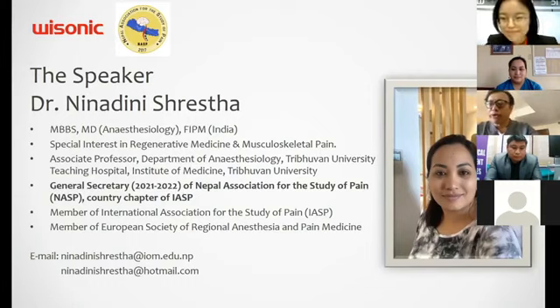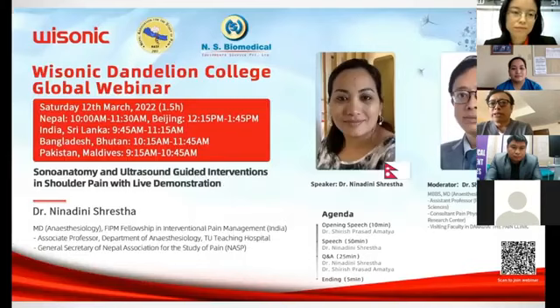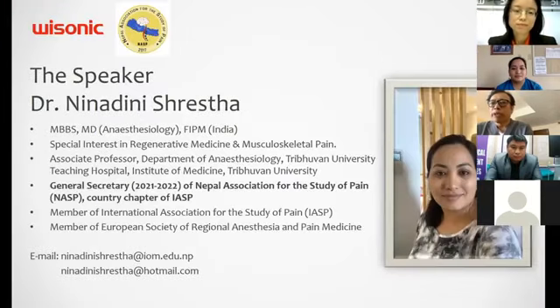Thank you, Mandy, for a wonderful introduction. Today, WeSonic, Dr. Ninadini and I, as well as the whole Nepal Association for the Study of Pain, would like to conduct a seminar on a very important topic, based upon ultrasound, intervention, and sonoanatomy, for the diagnosis of pain.